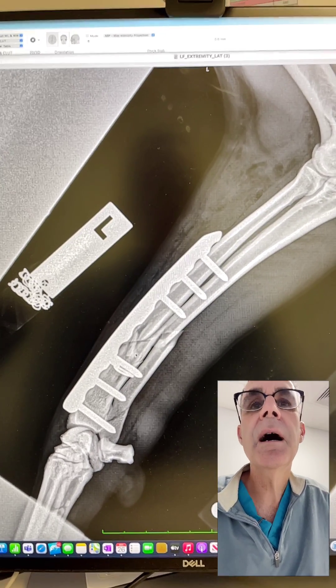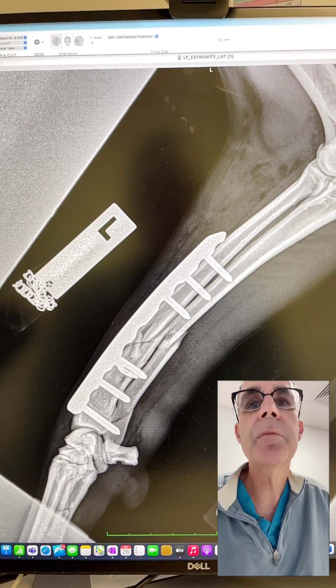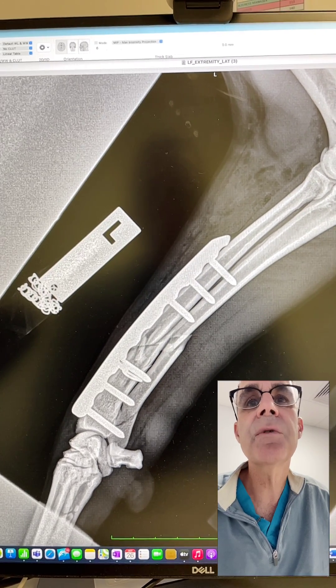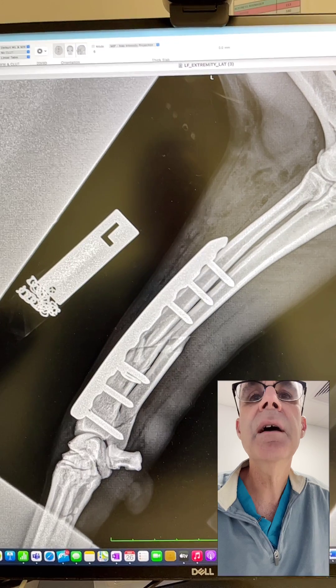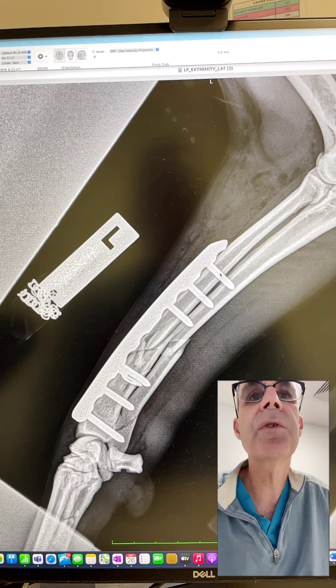Looking at the lateral view, we've got all this comminuted fracture down here. That fissure fracture was extending kind of down in this direction. We've got a nicer closure on there and it seems to be reduced really nicely. I have three screws below, three screws above, so six cortices above and below.